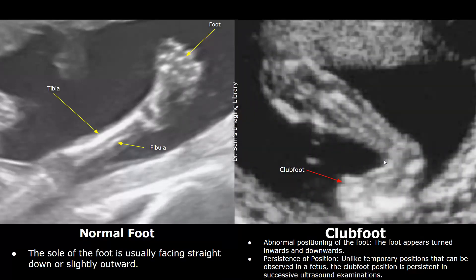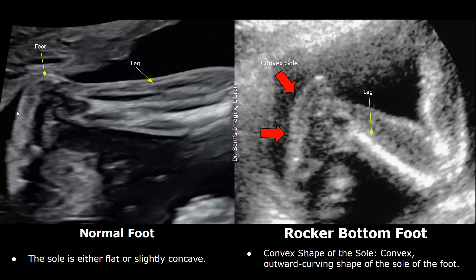In a club foot, there is abnormal positioning of the foot — the foot appears turned inwards and downwards and will persistently remain in this abnormal position. This type of fixed position is termed club foot and can be seen in a fetus with Trisomy 18. The normal shape of the sole is either flat or slightly concave. In a rocker bottom foot, the sole will have a convex shape, bulging outwards instead of being flat or slightly concave. This foot appearance is termed rocker bottom foot and can be associated with Trisomy 18.